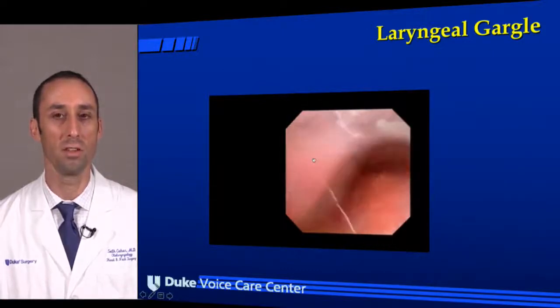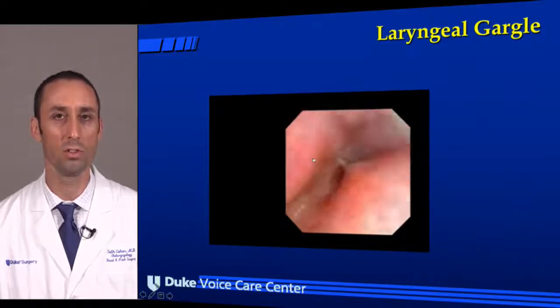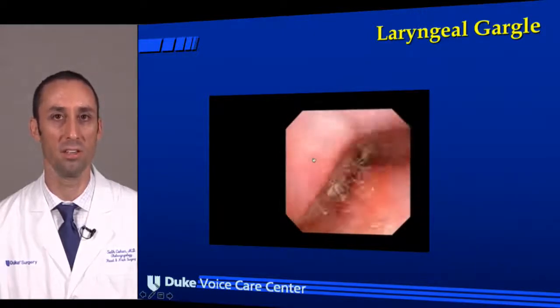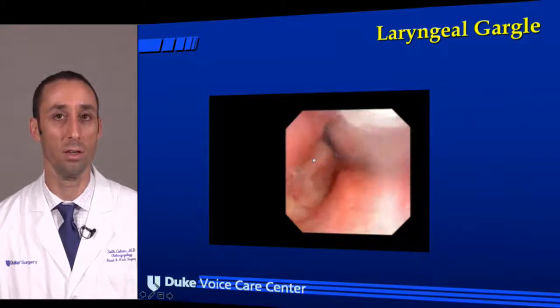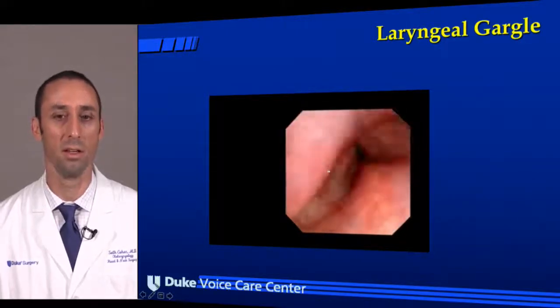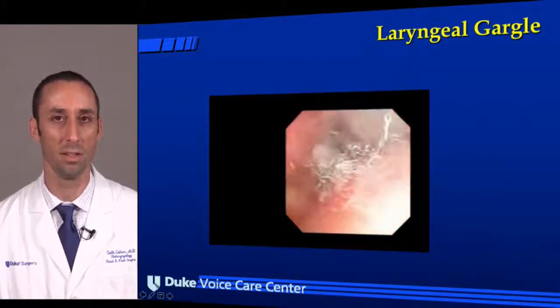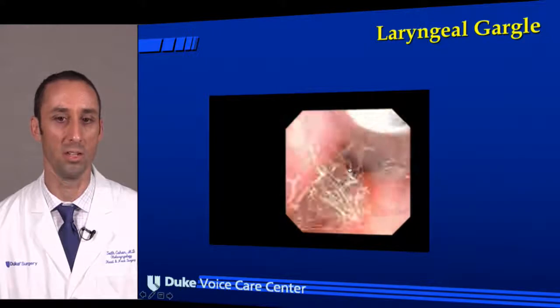You want to make sure that you've already started to anesthetize them a little bit beforehand, because if you just drop a cc or 2 cc's very quickly, they're going to feel that and they're going to swallow, and you're going to anesthetize the esophagus as opposed to anesthetizing the larynx. So a good, slow, careful anesthesia is the key to success with these procedures.